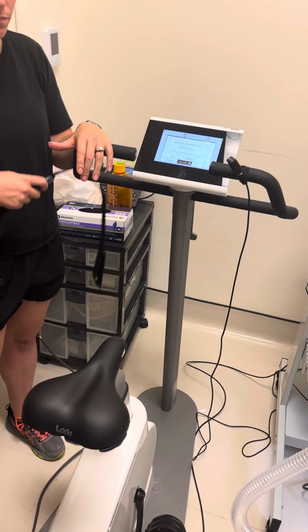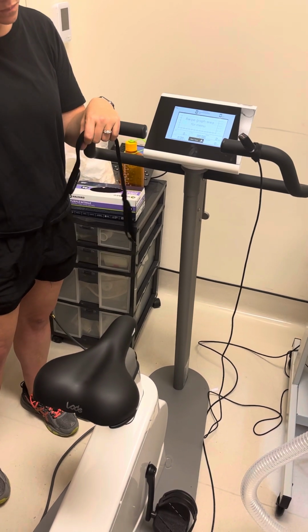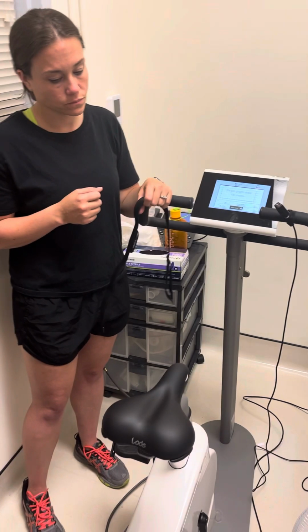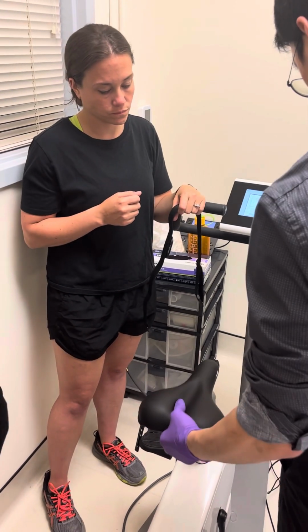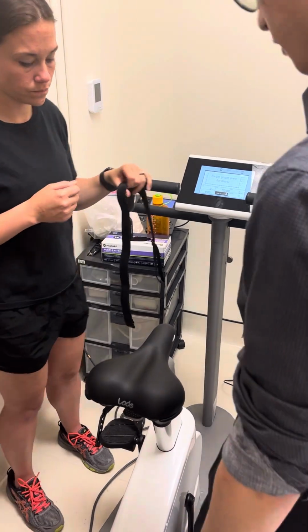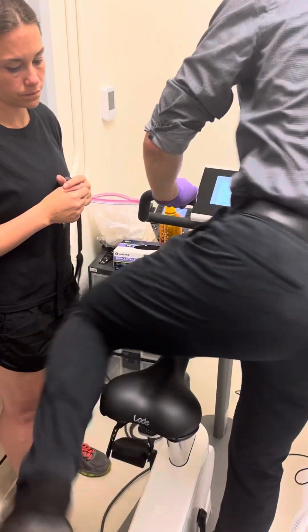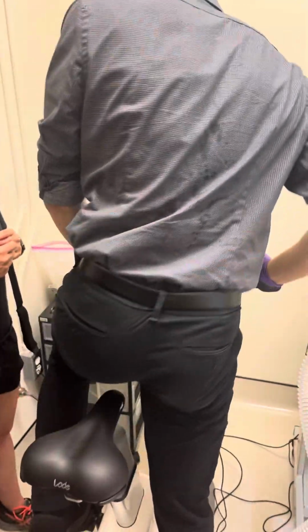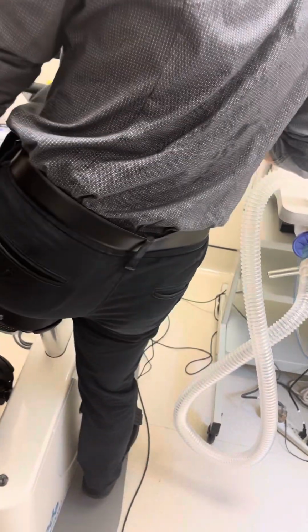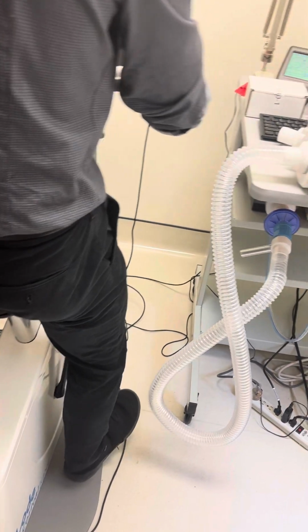Seat height. Let's move this right here. Okay. So when you do the seat height, it's very simple. You might want to actually have the person get on the bike first. So have them get on the bike and then just raise themselves up and then change the height. And I think what's dictated in the protocol is there has to be a slight bend at the knee at the bottom.